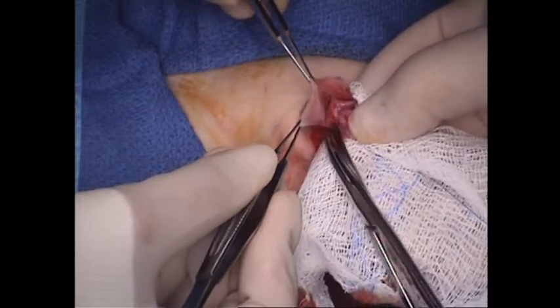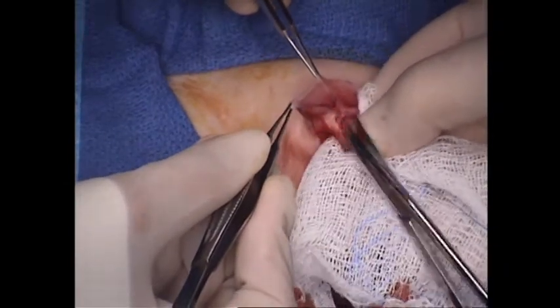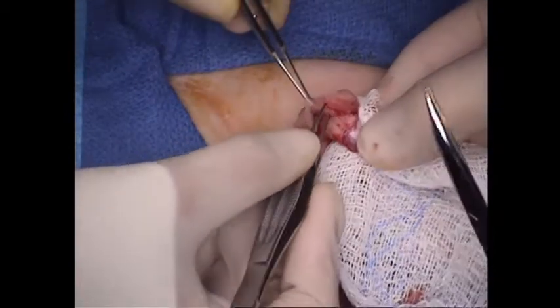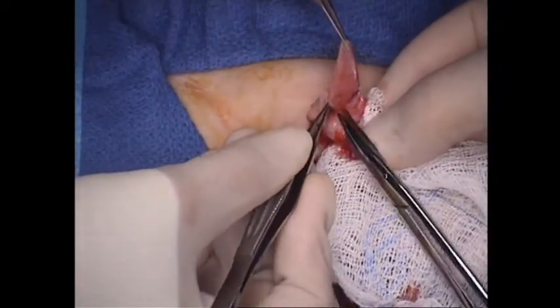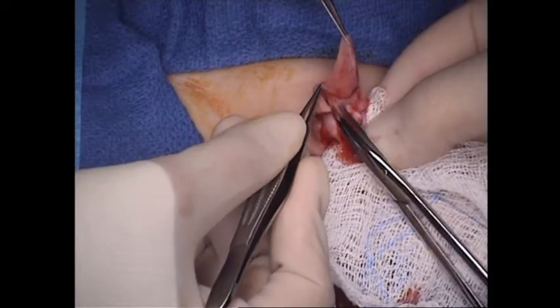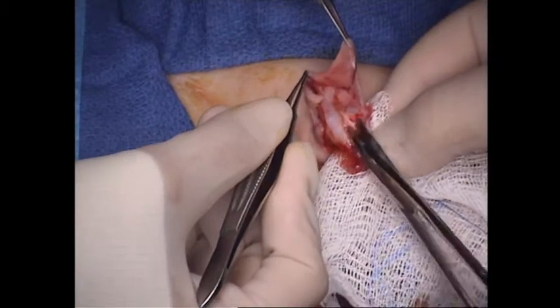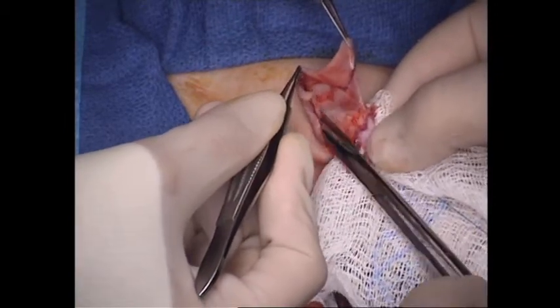So now we'll shift planes. We were directly under the skin on the ventral surface, but here on the dorsal surface, the dartos tissues will be going with the skin, will be on top of Buck's fascia here in our dorsal plane.